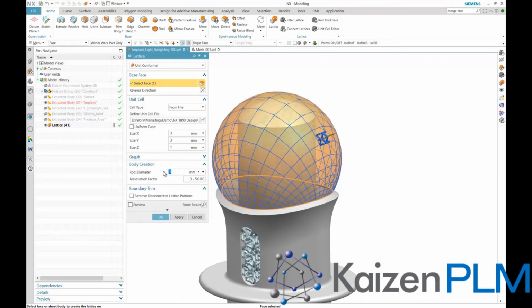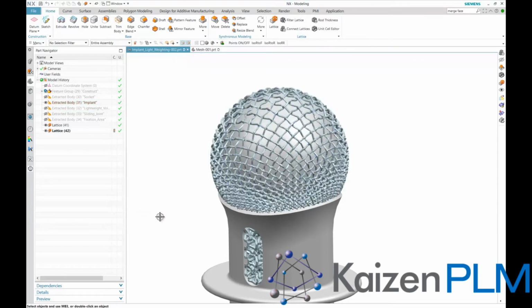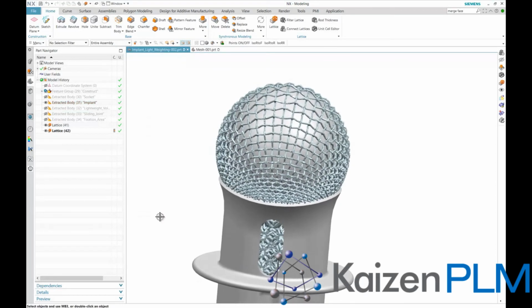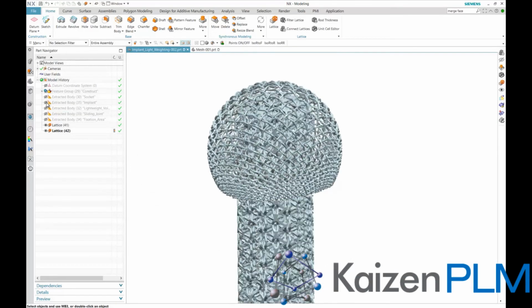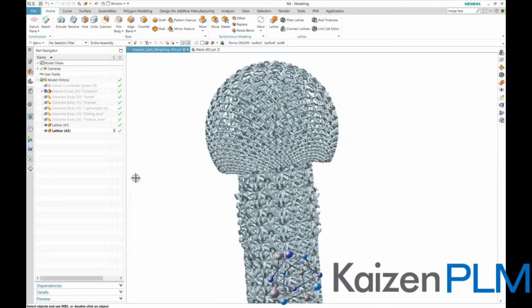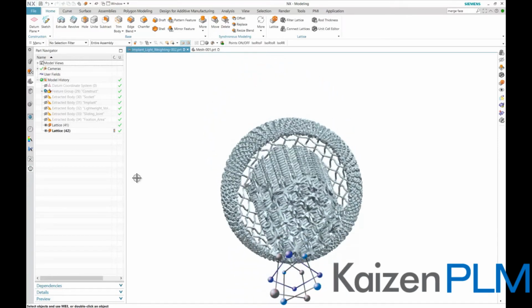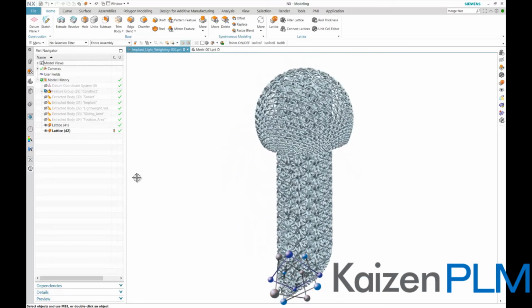Should this lattice have been the reinforcement of, let's say, an entire polymeric design, we might want the two lattices connected. In order to do that, the core lattice would then, however, most likely have been following the outer shape. This can easily be fixed with this release of NX, as lattice now is an associative feature. To demonstrate, we will change the inner volume defining our first lattice.